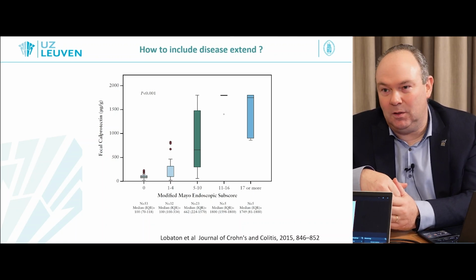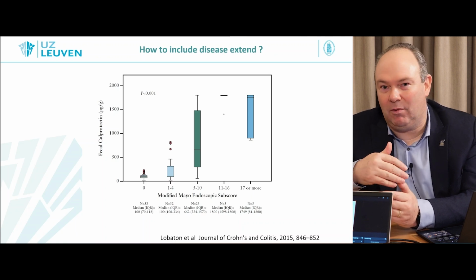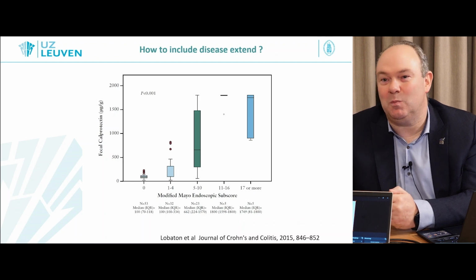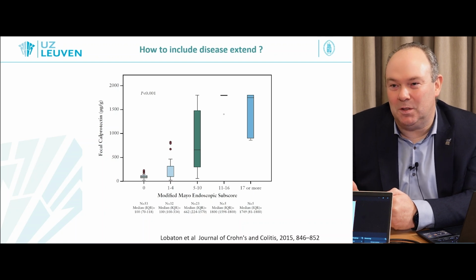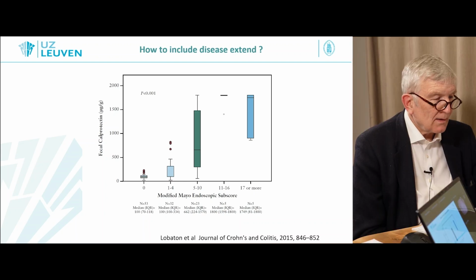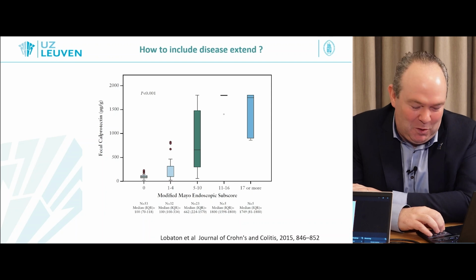And also, again, the score will be more prone to change if you give the patient therapy, right? Because let's say you have a left-sided colitis before your therapy, which is Mayo 3 from 0 to 60 centimeters, and that decreases to 5 centimeters with one ulcer, it would still be a Mayo 3. So for studies, this is a bit cumbersome, because on paper there would be no change for that patient, while the patient's probably doing much better.